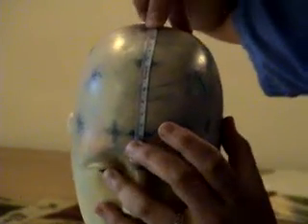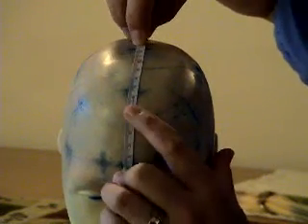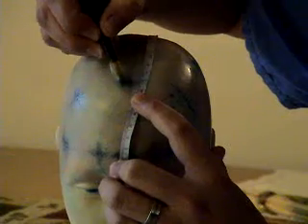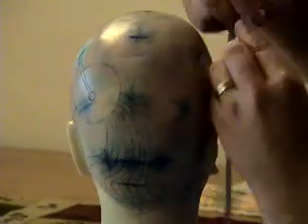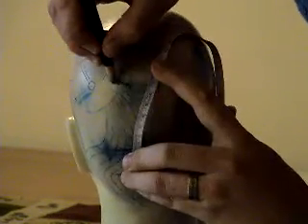And then between these 2 points, half of 12.5 is 6 1/4. So you're going to come up to 6 1/4 and mark across. And we're going to do the same for the back of the head. You're going to come up from OZ to right up here, which is now known as CZ. Mark across the tape at 6 1/4.